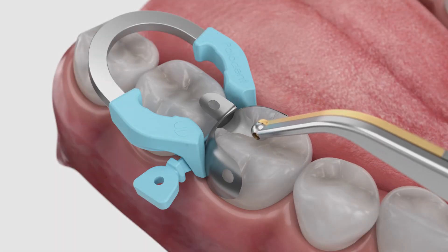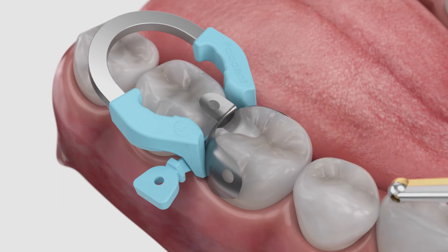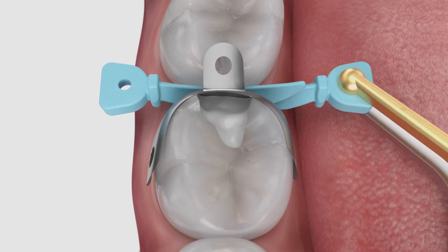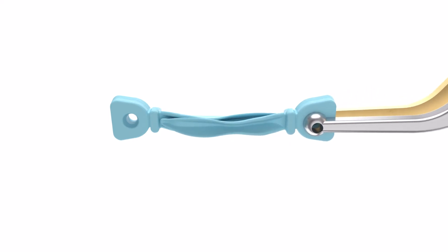If needed, lightly burnish the matrix against the adjacent tooth. The pin tweezers have a built-in ball burnisher for this purpose. If needed, a second Wedge may be placed from the opposite side without removing the ring, due to the accommodating shape of the tines which allow the Wedge to be placed after the ring.